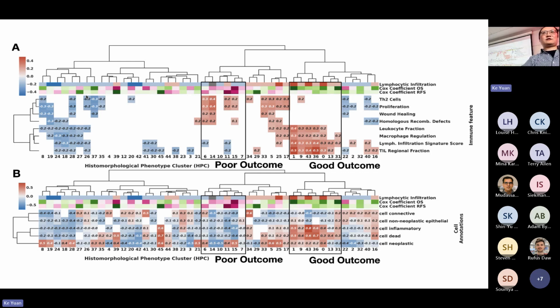That's a good question. So we didn't actually change the size of our patches. But you could imagine that it depends on the size. You capture different types of features in the image. In some cases, it depends on whether that feature is so small that it's a single-cell based feature. Sometimes it may have stronger or actually weaker association with the outcome.